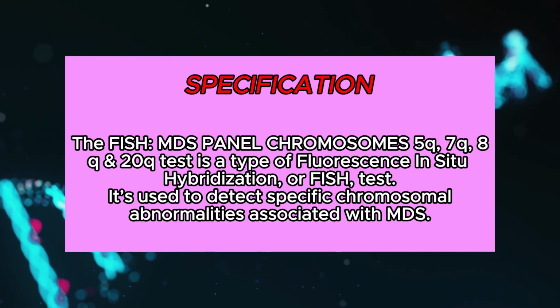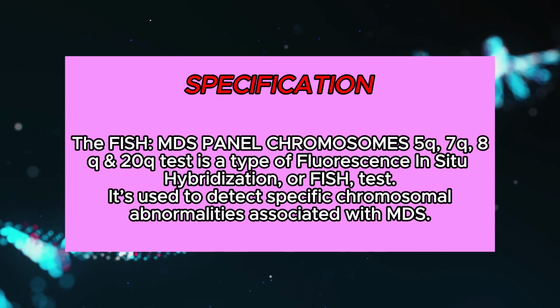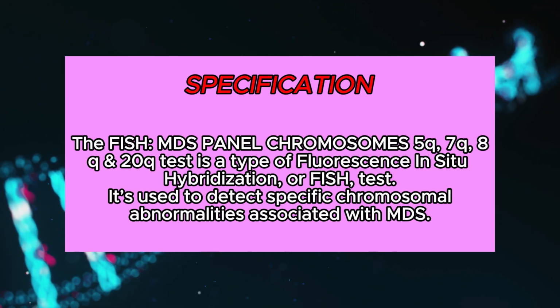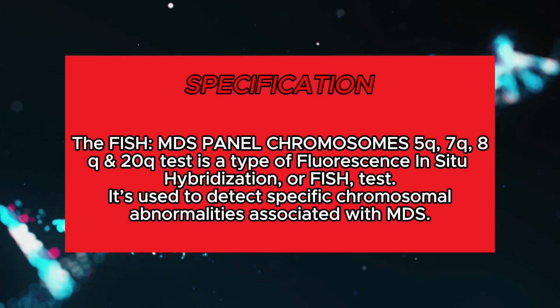Specification of the test. The FISH MDS panel chromosomes 5q, 7q, 8q, and 20q test is a type of fluorescence in situ hybridization, or FISH, test. It's used to detect specific chromosomal abnormalities associated with MDS.